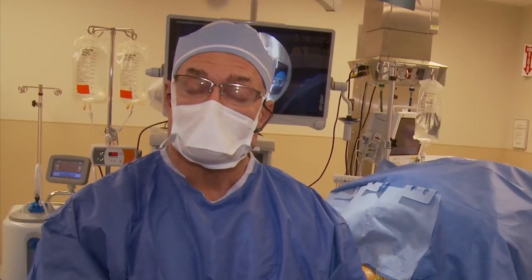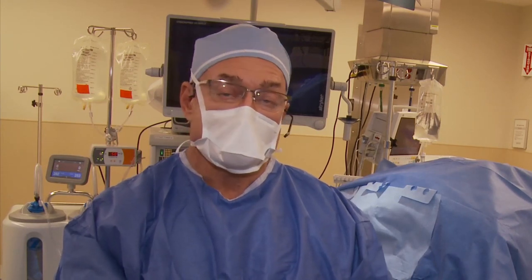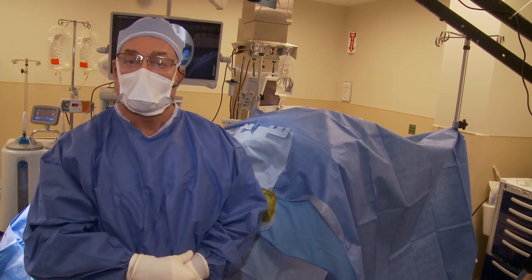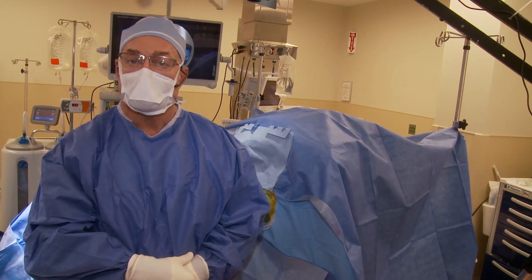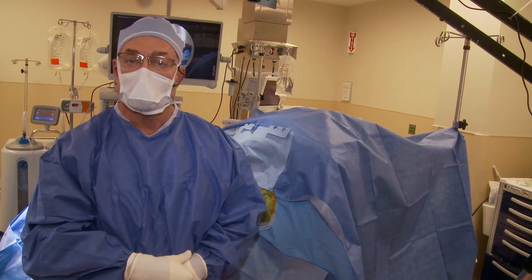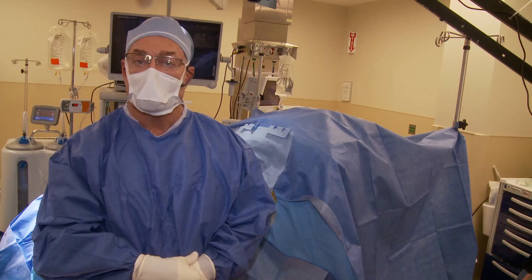A magnetic resonance imaging scan demonstrates a significant bursal-sided rotator cuff tear with probable communication with the glenohumeral joint. He's failed conservative management, and the surgical repair should be able to get him back to all the activities that he desires. His muscles look good, the rest of the tendon looks good, and we should be able to restore this back close to his normal abilities before he had his accident.